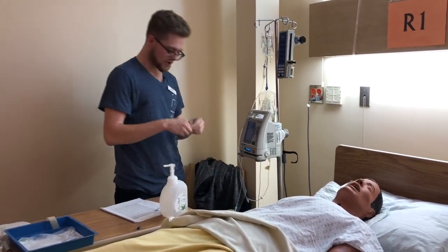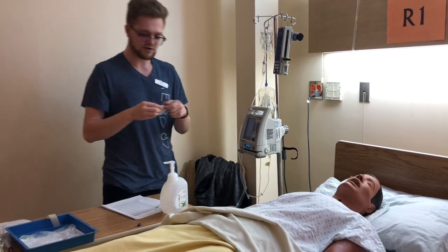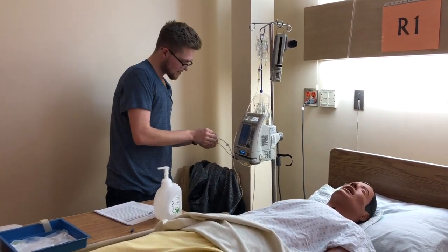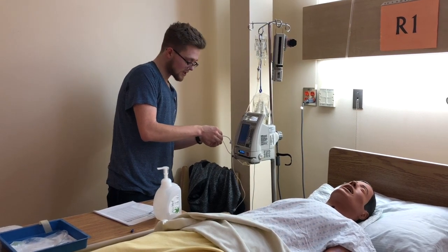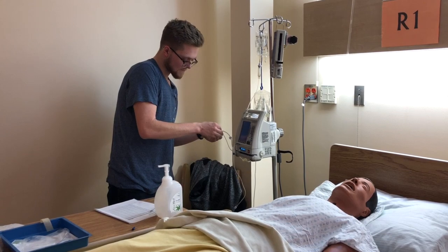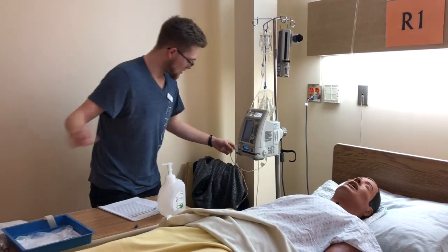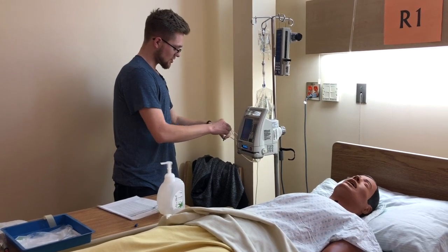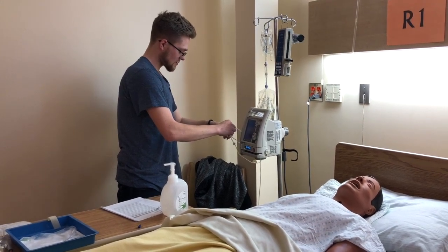So now we're going to be inserting into the connection site, so I'm going to be wiping down this port here. We want to make sure that it is before the pump there so that the pump can better regulate it. So we'll do 30 and 30 like before. Okay, good. So now we're going to be connecting, and this is also sterile once this cap is removed, so make sure you're not touching any of that there.